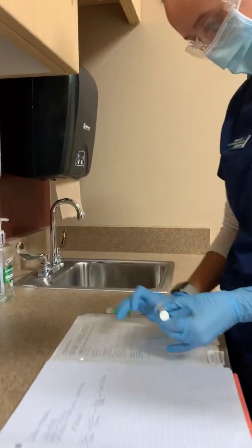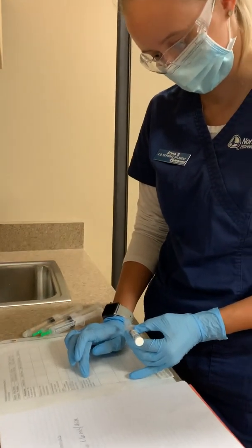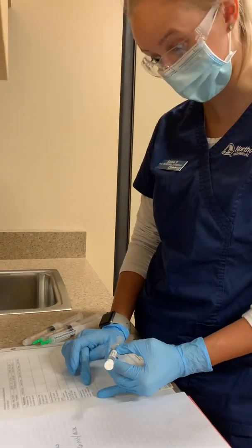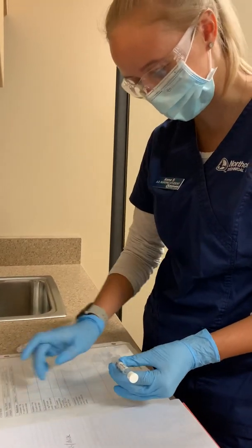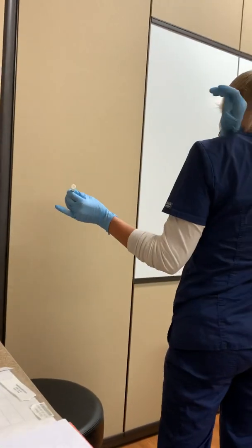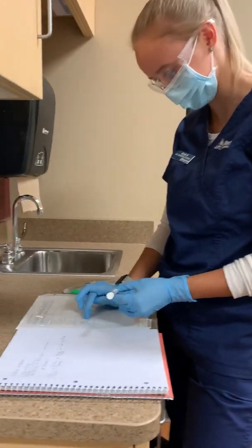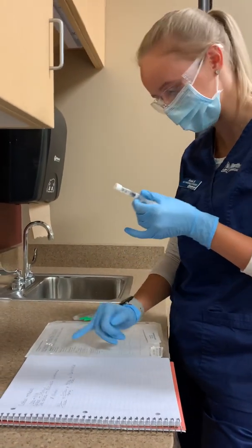So Mary Smith, Zofran 4 milligrams, which is 1.6 milliliters, IV push every 4 hours for nausea. Mary Smith, allergic to morphine. Zofran, 4 milligrams IV push every 4 hours as needed for nausea, and that is 1.6 milliliters.